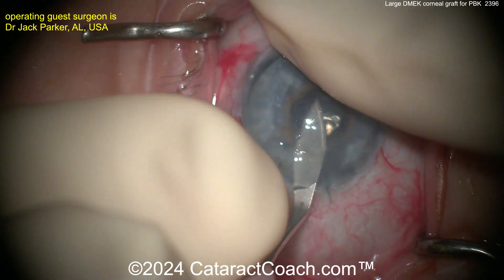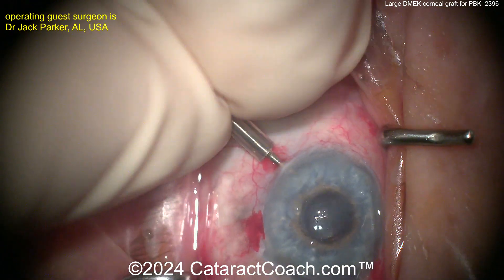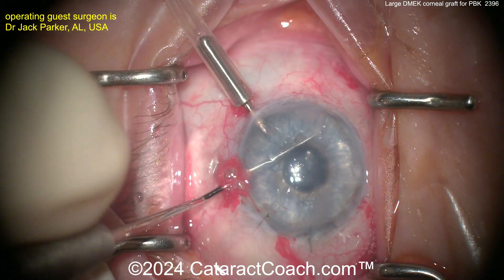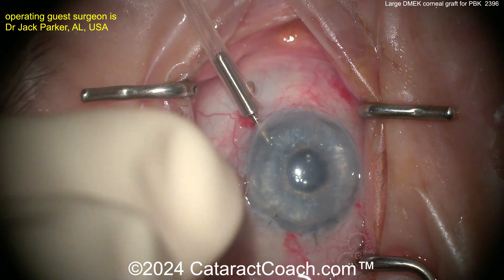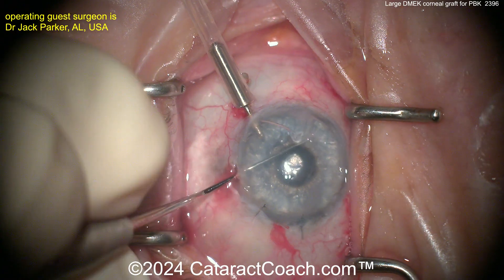Here making an incision with a keratome, entering the anterior chamber. Obviously the first step in DMEK — here's an AC maintainer — the first step in DMEK is you've got to take off that existing host endothelium. So here scoring Descemet's 360 degrees, and a very large graft is being planned here.